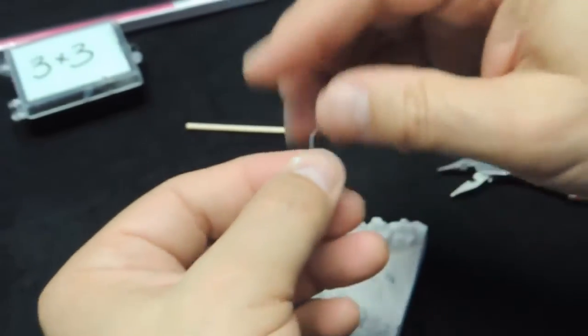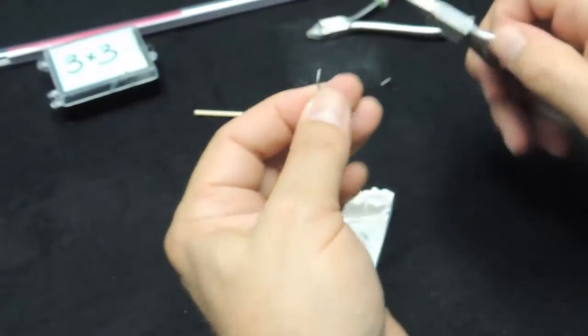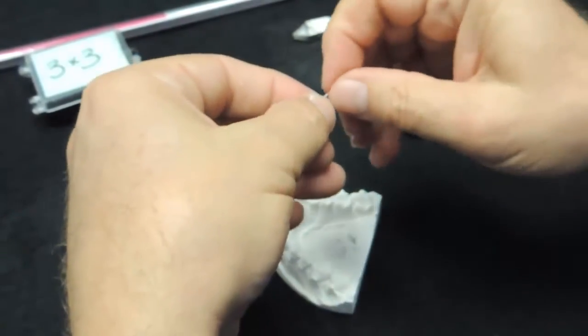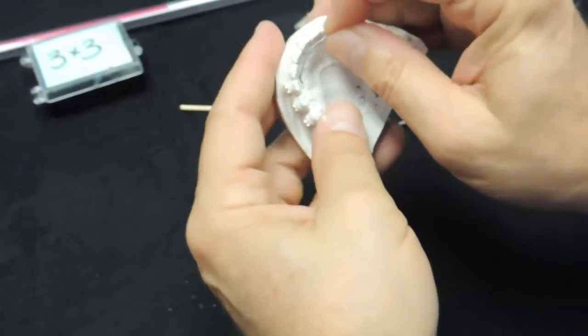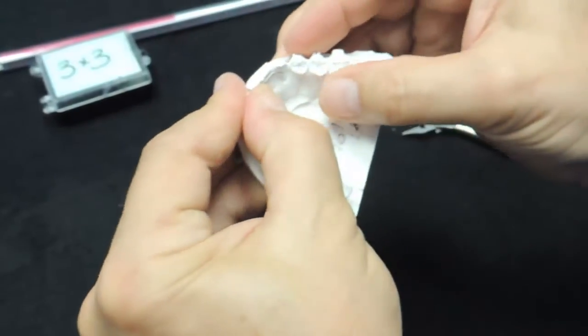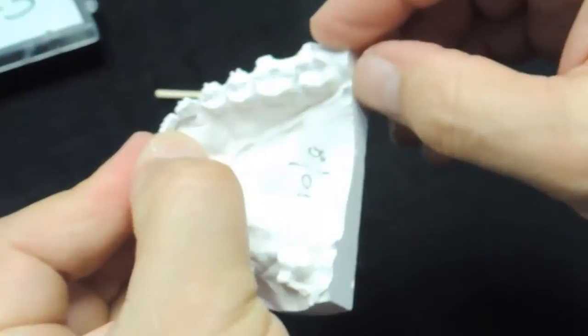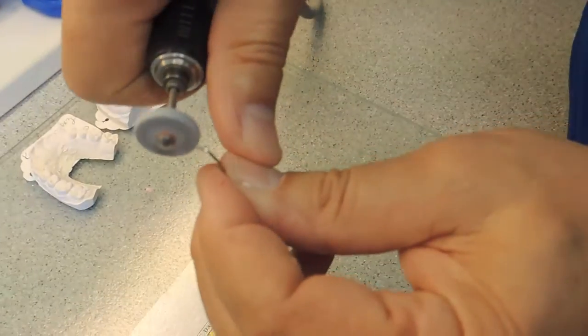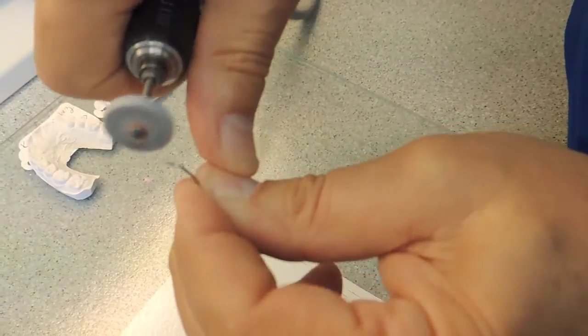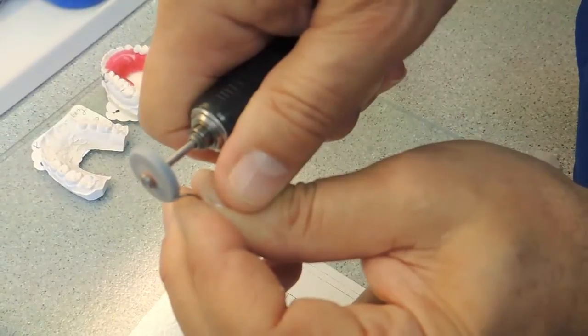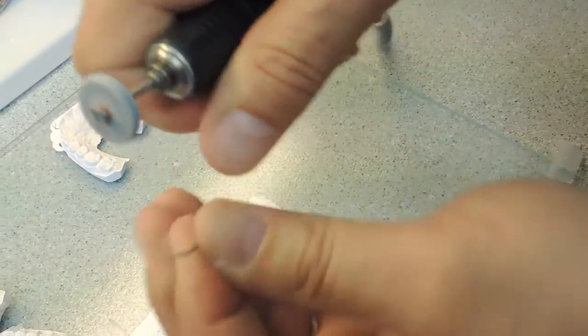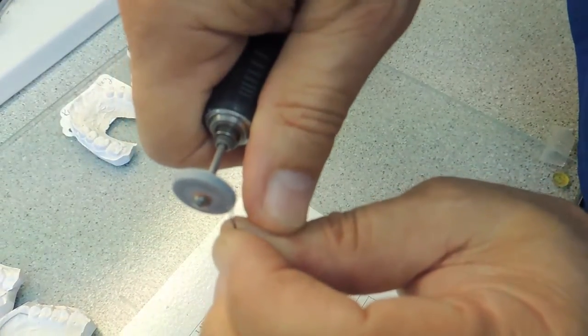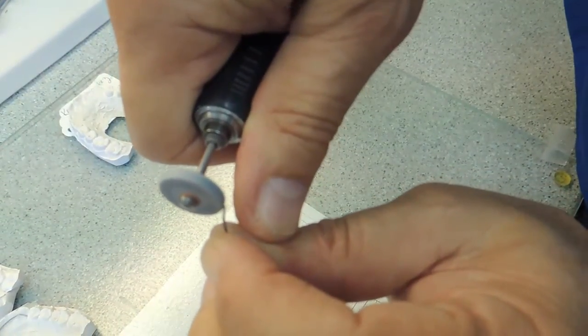The last thing I'll do before we fit it in the model is feather edge the ends of these wires so that the composite doesn't have to be as thick. You want to end up with the end of the wire at about half way onto the cuspid like that. So last thing we do is feather edge the end of the wire with either a diamond bur, green stone, heatless stone, anything you want to do here just to make that thinner so that the composite doesn't have to be as thick.